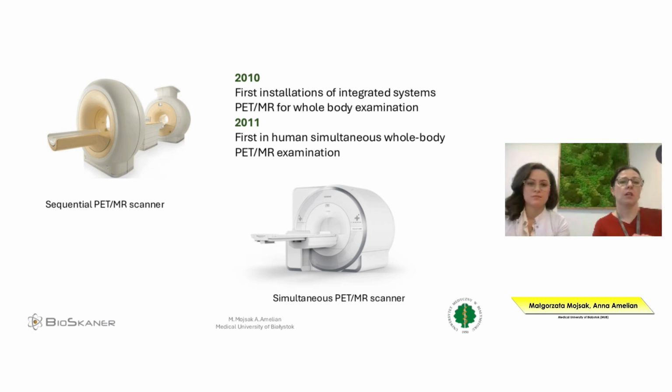So it was really hard to put it together in one piece of equipment, because photomultipliers did not play their role in a proper way. It was very hard to obtain a proper image. But then the multipliers were changed, and now they are all together in one scanner.